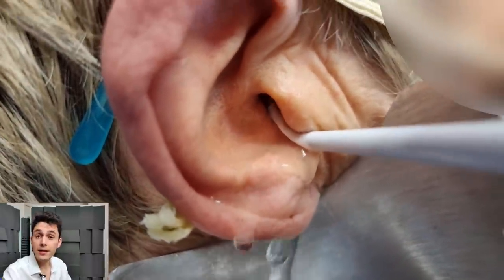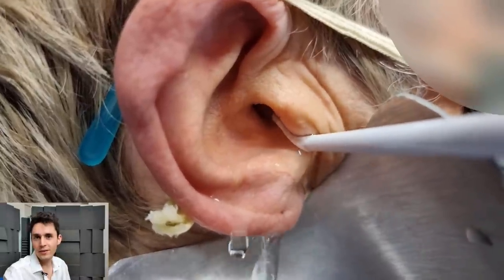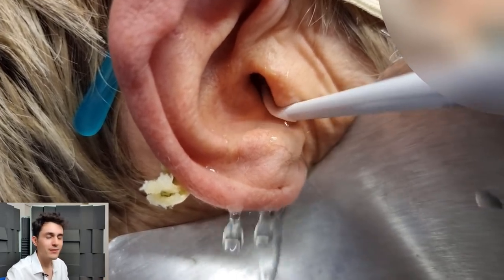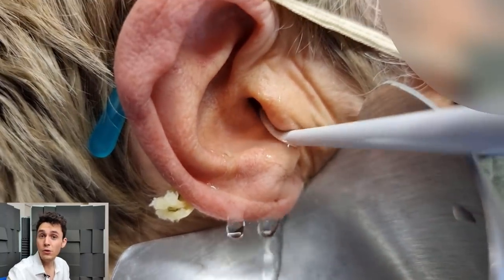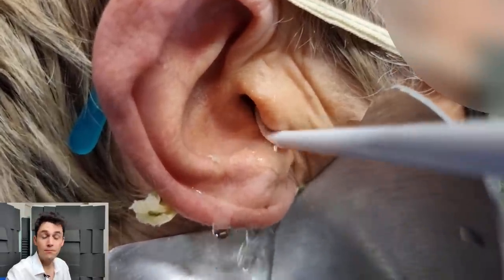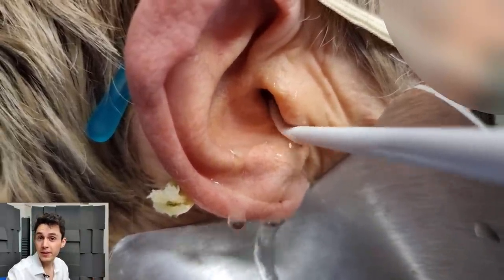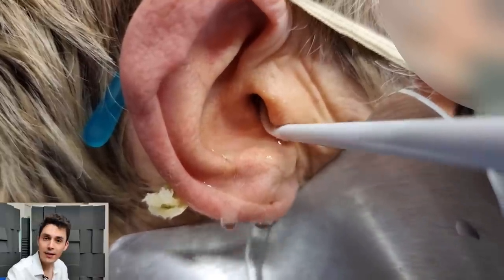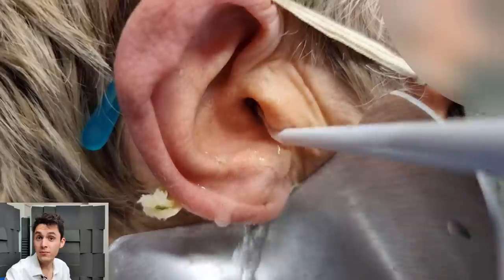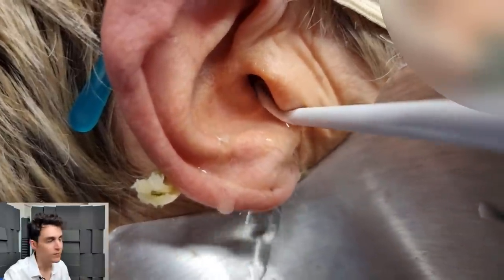Incidentally, the water needs to be about 37 degrees Celsius. If it's half a degree either way it's not too big a deal, but if it's too cold or too hot, that will induce vertigo — which has happened in the clinic before. Basically, if it's too cold or too hot, you'll be cooling or warming the fluid inside the semicircular canals, which creates currents inside your inner ear. That tells your brain that your head is moving, and your brain will make your eyes move to compensate for that phantom movement. That's what induces the vertigo, so the temperature of the water is very important.